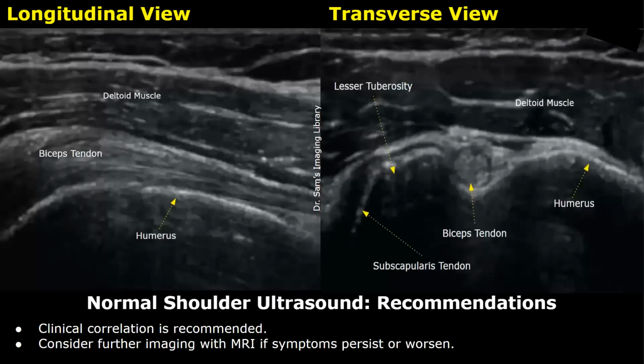You can also write this section called recommendations. It includes statements such as clinical correlation and referrals or recommending additional imaging modalities.